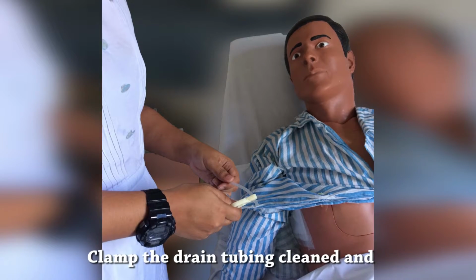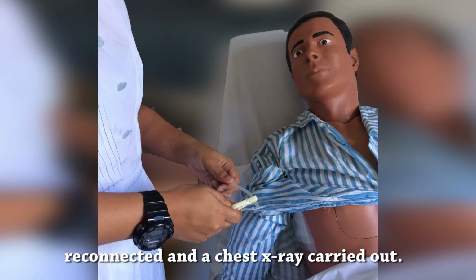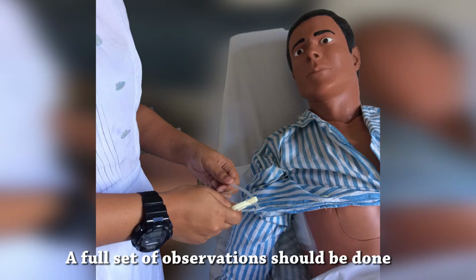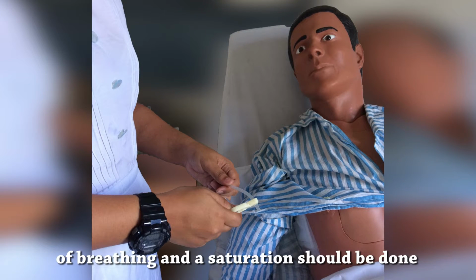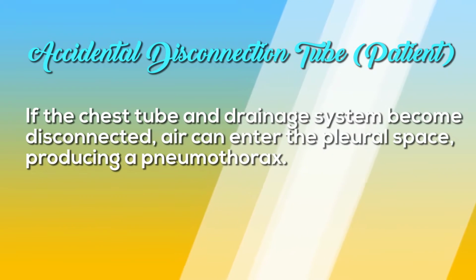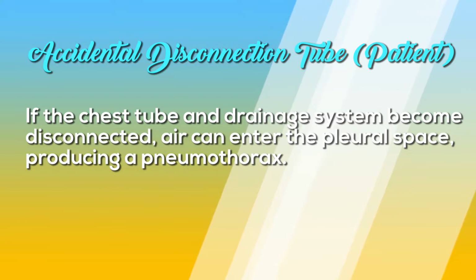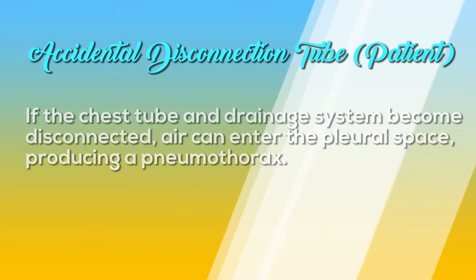Clamp the drain tubing, cleaned and reconnected, and a chest X-ray carried out. A full set of observations should be done, taking particular note of chest movement and work of breathing, and a saturation should be done. If the chest tube and drainage system become disconnected, air can enter the pleural space, producing a pneumothorax.